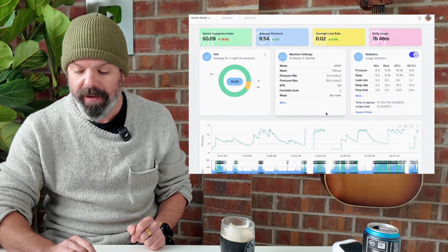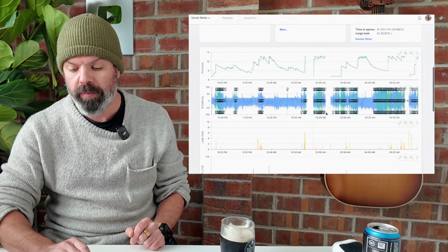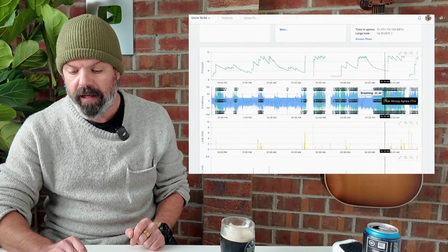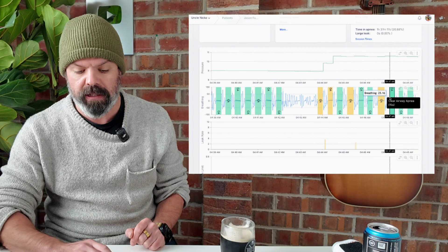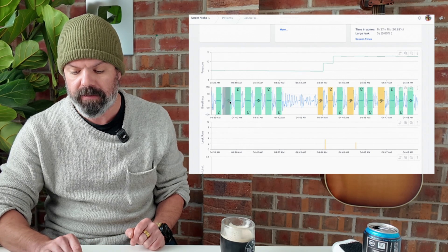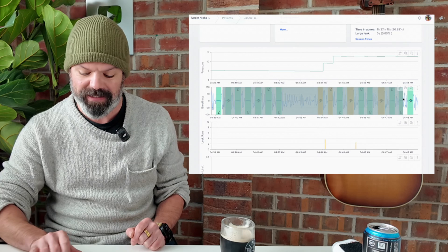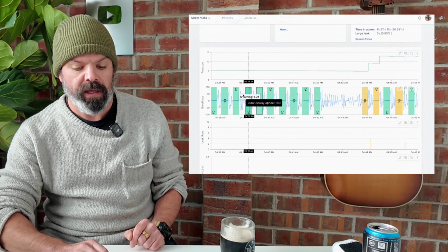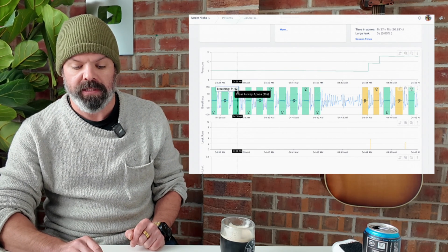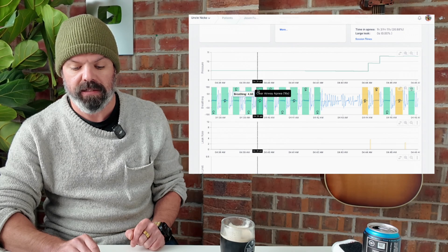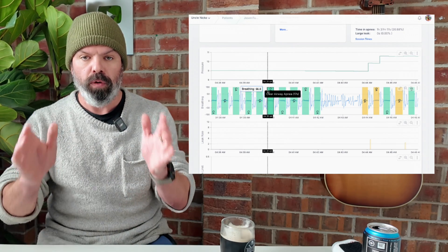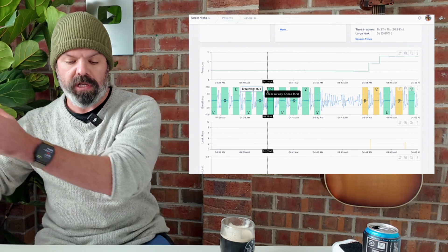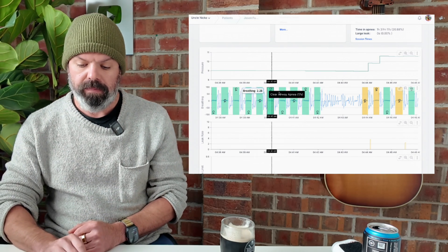I'll tell you why in a moment. If we come down here, we can zoom in on the breathing trace and check out all these clear airway events. This is a big problem. Here's all the clear airway apnea, 16 seconds, 15 seconds. It's just a beautiful cycle. Pause, couple of breaths, pause, couple of breaths.